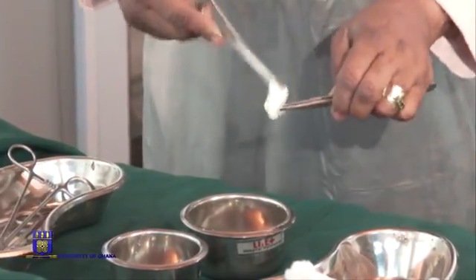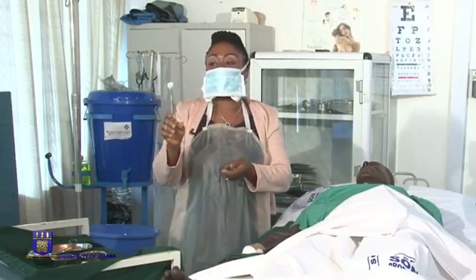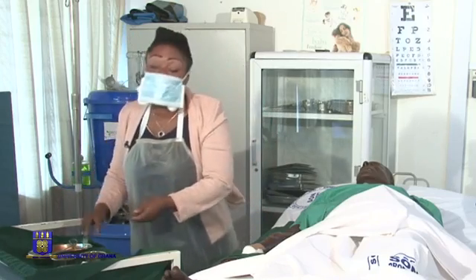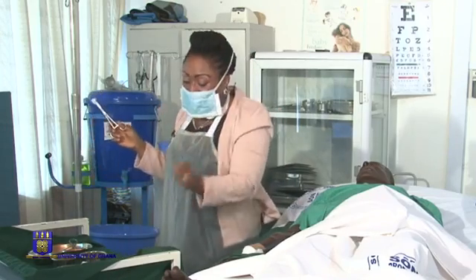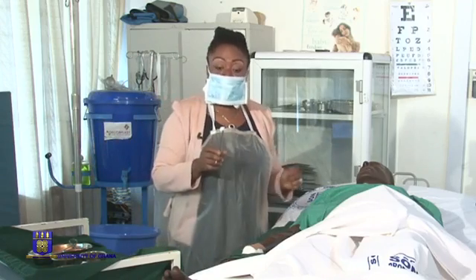Make sure you have enough lotion and make sure the tip of the swab is covered entirely so that the forceps will not touch the patient's wound. Leave the dissecting forceps on the sterile field to avoid contaminating it.